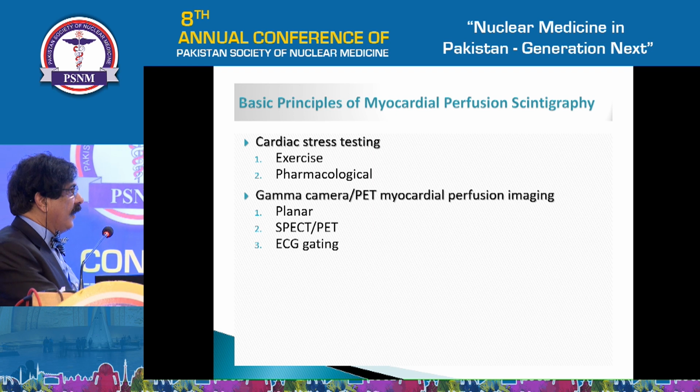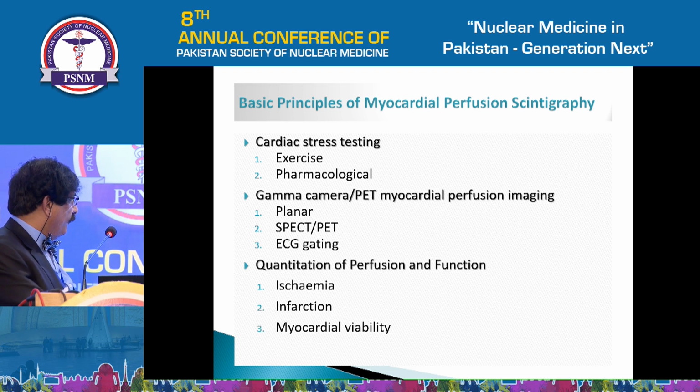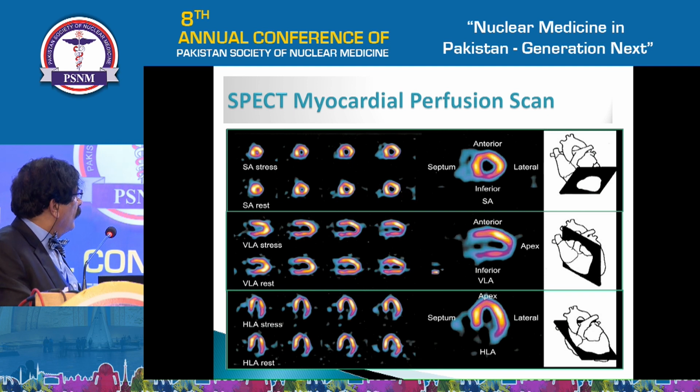For quantitation, we can quantitate perfusion and function to diagnose ischemia, infarction and myocardial viability, and also detect cardiomyopathies.